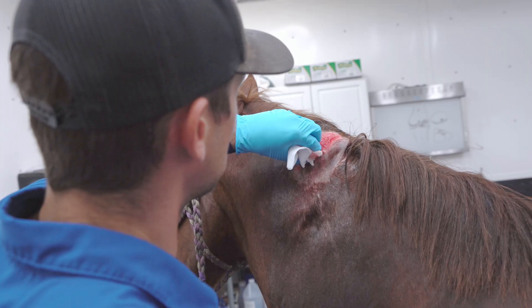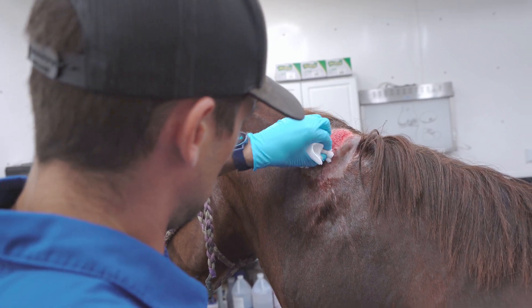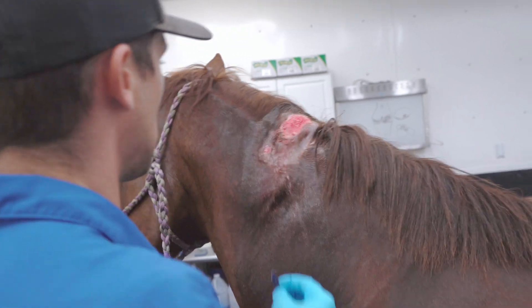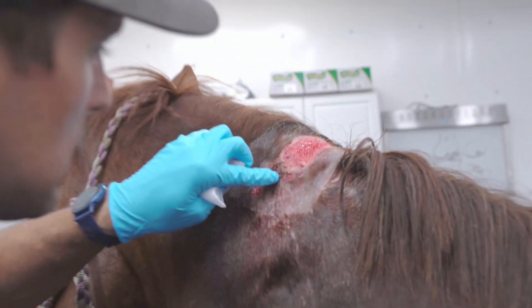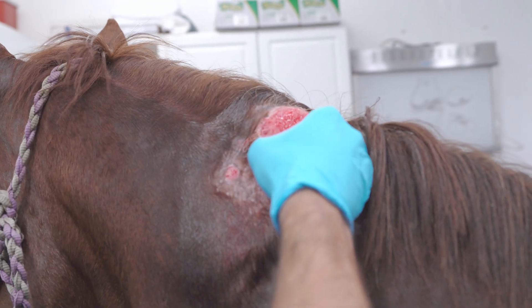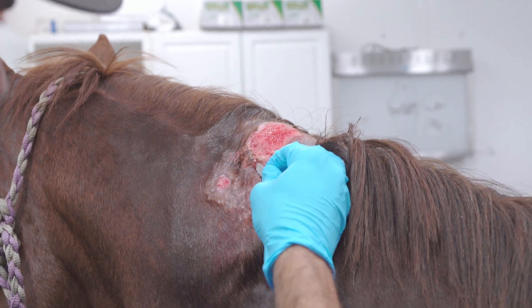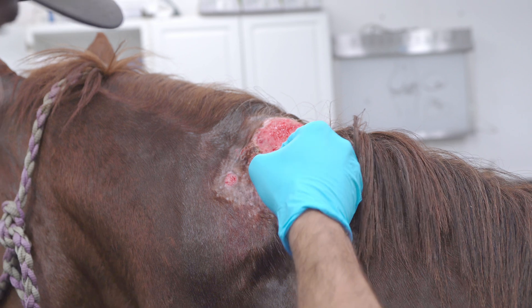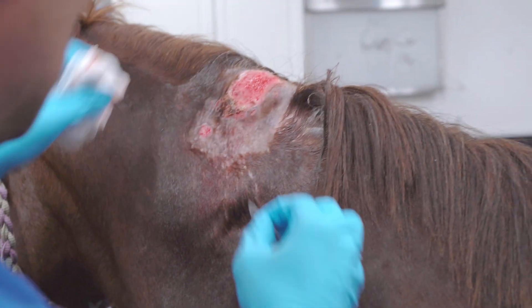Now we're debriding some of this necrotic tissue and taking out some of these little inflammatory granulomas — basically inflammatory clumps of nasty stuff. You can see a nice big one right there. Sometimes they're called sulfur granules — basically it's a collection of worm or nematode larvae and inflammatory or immune cells clustered together.